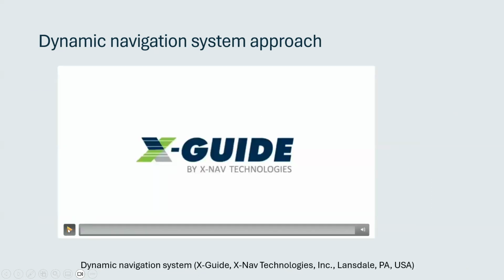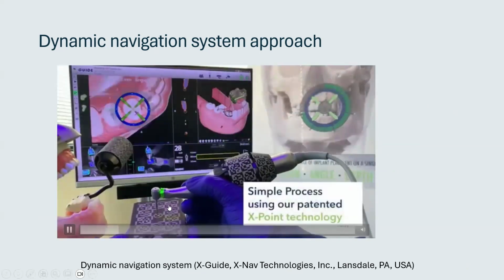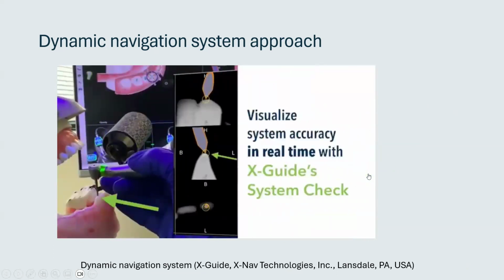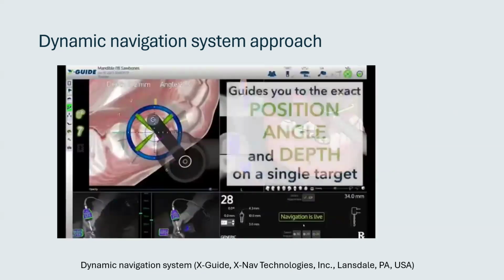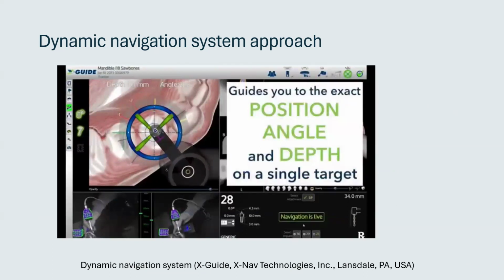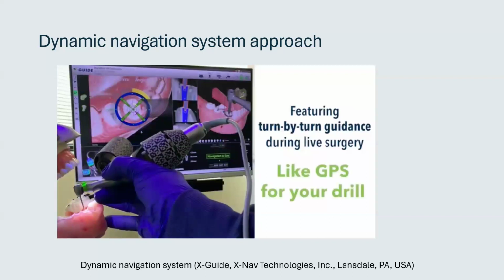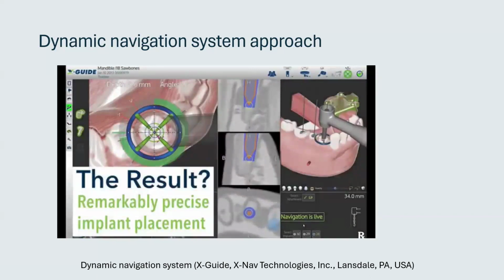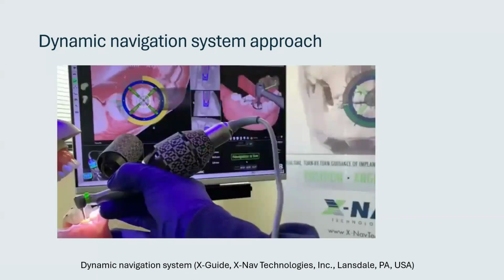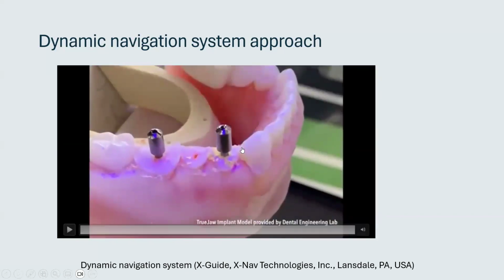Okay, here is a video for more illustration. This table is for calibration of the handpiece. We can see how the clinician can see exactly the intended position of the implant and where they are drilling. And here are the final implants.